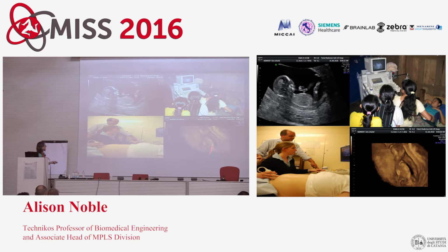If we look at the data, this is a cute little example, typical of 3D ultrasound. This is a little baby that suddenly becomes very tired in a few seconds, rubs its eyes and goes to sleep. If you watch, I'm about to do it now, I think. There we go, going to sleep. This is very typical. This is clearly the head. You can just about pick out movement here. There's a heart. And this one is training for the Olympics or something by doing exercises. That's a very classic view.